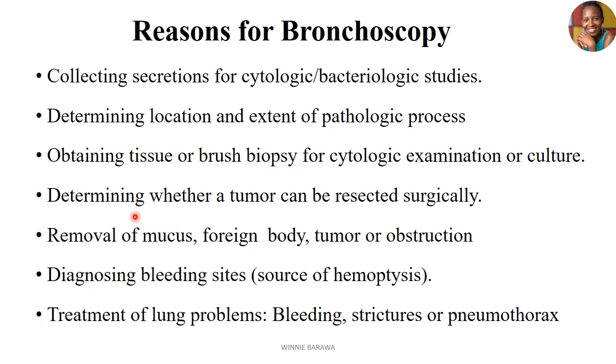And the other reason is to do a biopsy through bronchoscopy if you want to see whether a tumor has grown and you want to determine whether it can be resected surgically, or you can opt for other interventions like chemotherapy or radiotherapy.